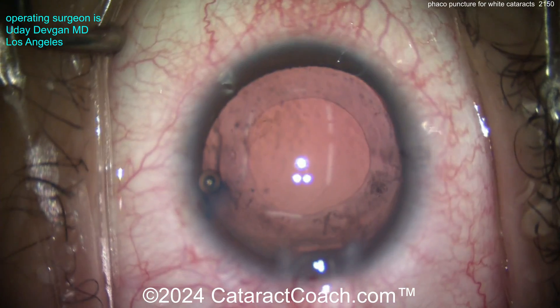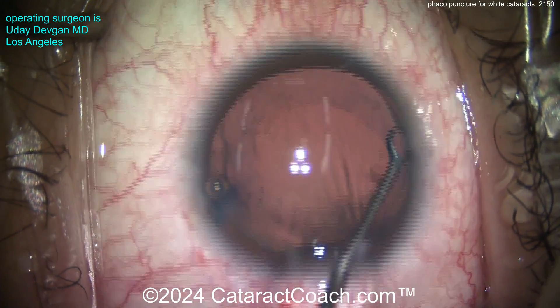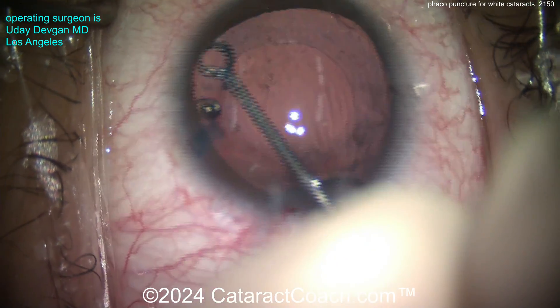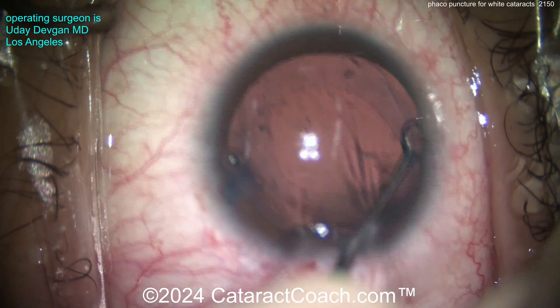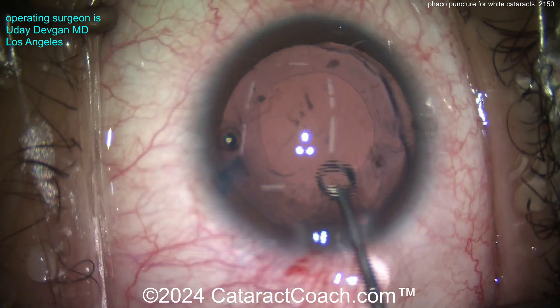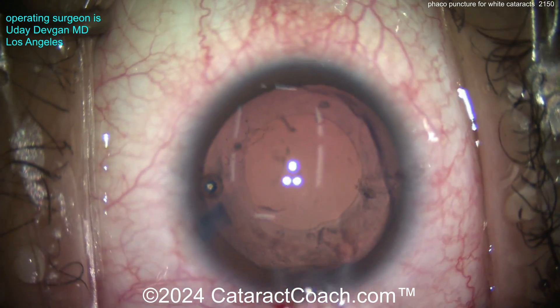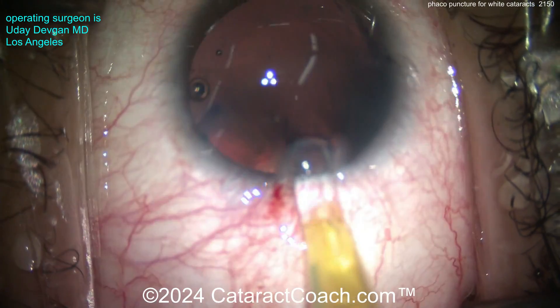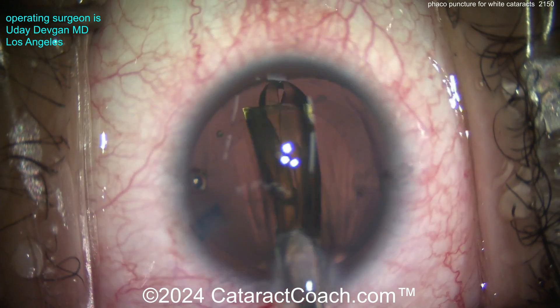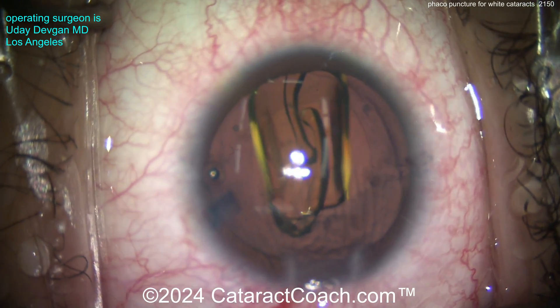Bag is full of cohesive viscoelastic. Going in with a polisher to polish up the undersurface of the capsule rim. You can get some of the material out, but it's not possible to remove all of it — there's some scarring of the capsule bag from the intumescent white cataract. Now let's get the lens in the bag. Single-piece monofocal acrylic lens, and a toric lens to address the patient's preexisting corneal astigmatism.